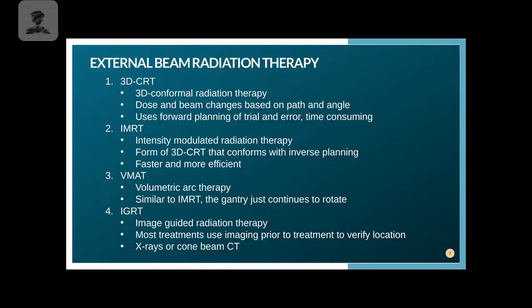And so the CT is going to come out looking like a CT slice, and we're going to be able to identify at multiple levels that we are in the correct location compared to how we were when we simulated the patient. So precision is what we're all about, and that IGRT, its job is to help with that precision.